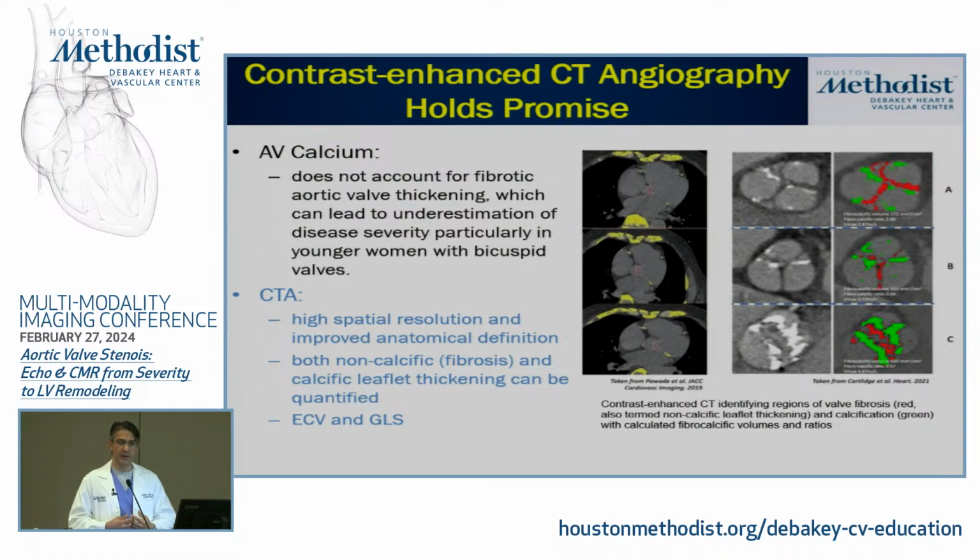So just telling you, which may be important as we develop new drugs that target the actual pathophysiology of this disease. CT, believe it or not, can also calculate ECV and global longitudinal strain, and that is upcoming stuff as well.